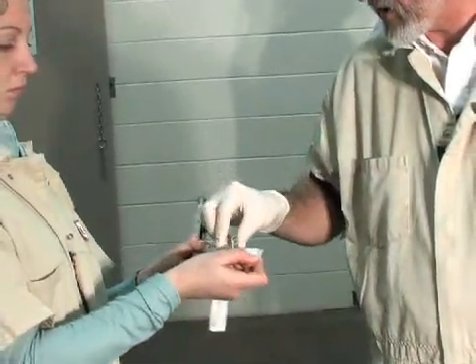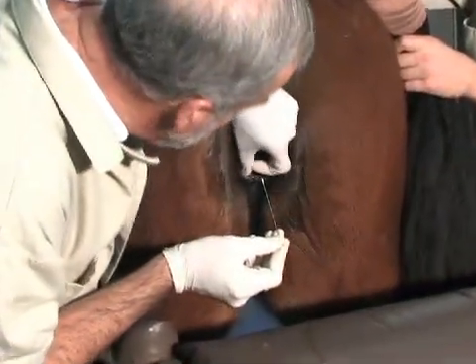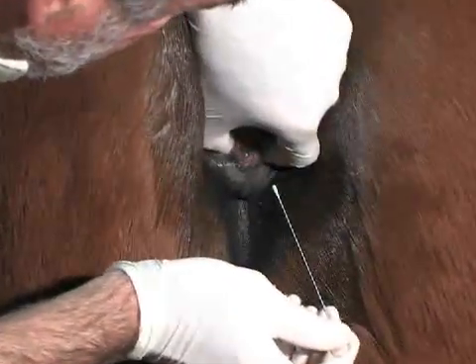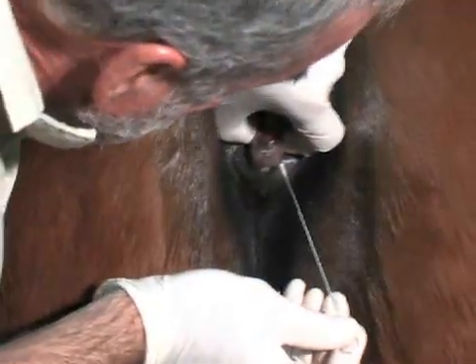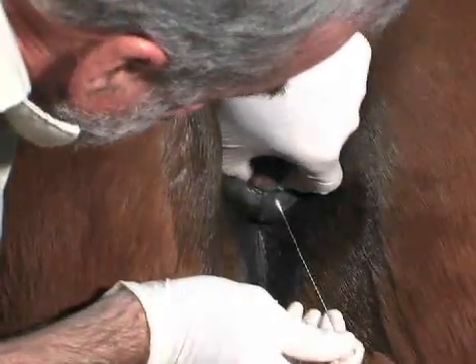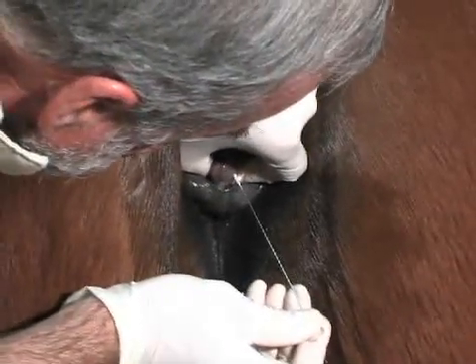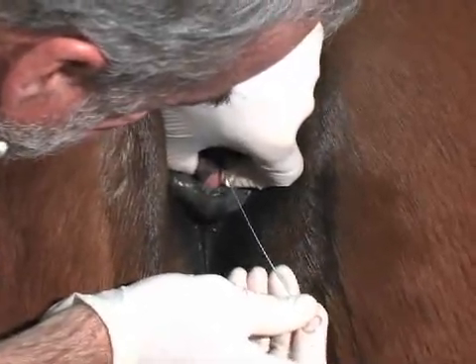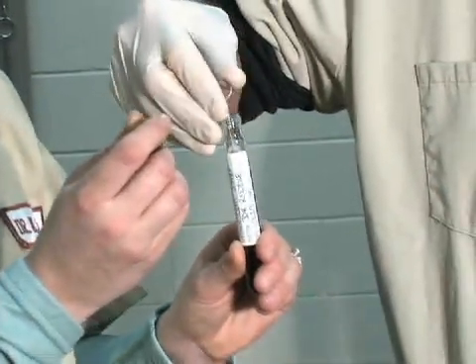We'll get another swab and we'll get a culture from the clitoral sinus. The sinuses are located on either side of the clitoris — there's a lateral and a medial. This mare is very clean, but typically there's some smegma within the sinus, which is a good way to locate the sinus. It's only necessary to culture one of the sinuses.